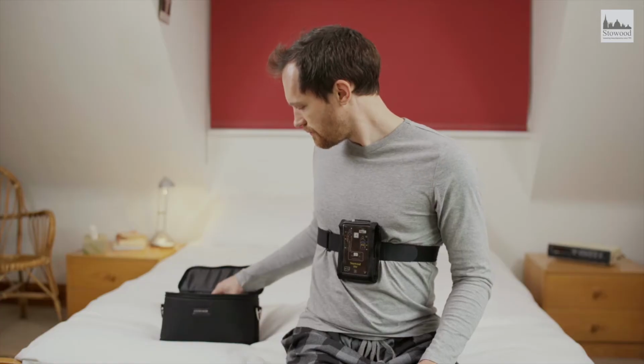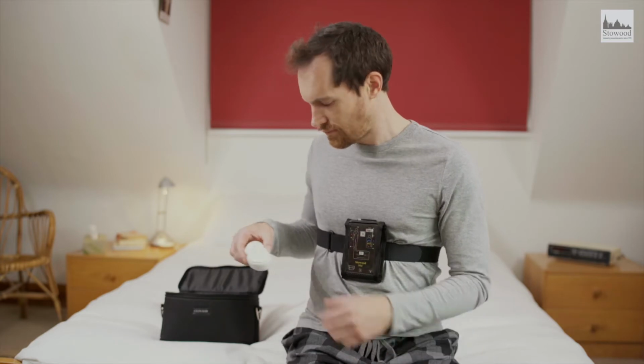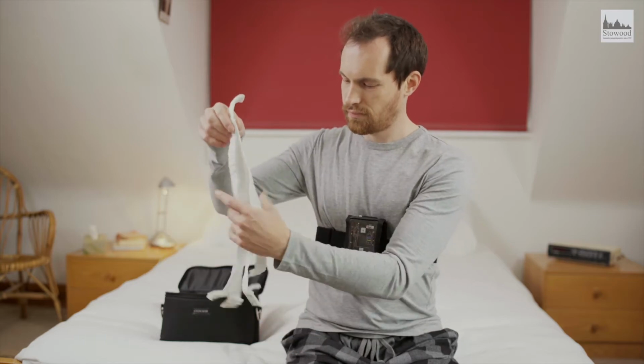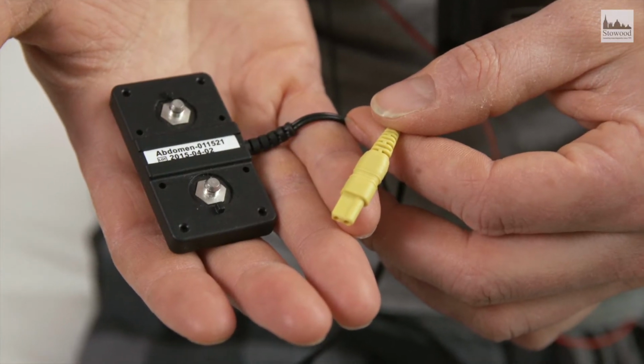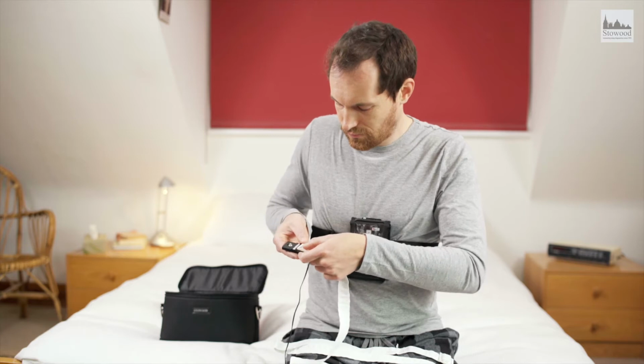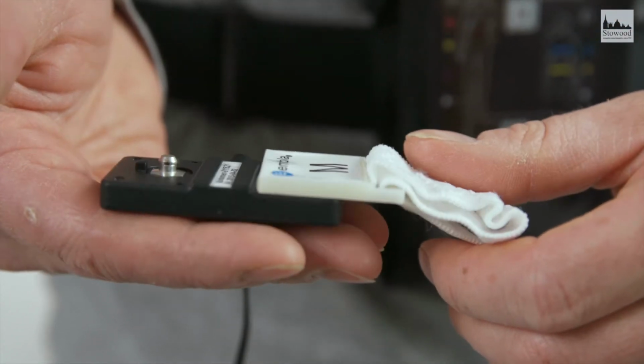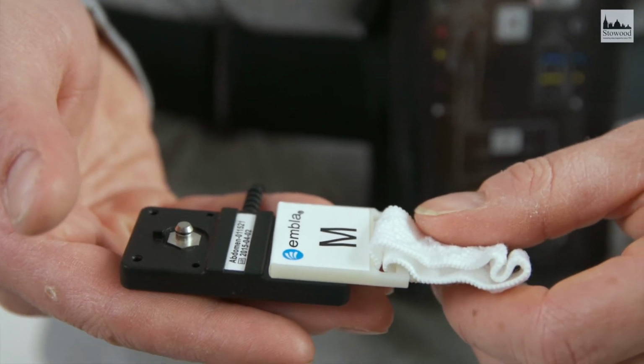Next will be the respiratory bands. Unroll the bands and find the abdomen sensor, which says abdomen on it and has a yellow plug. Take one of the bands and press it firmly to the stud on the sensor until it snaps in. Make sure there is no gap between the sensor and the band.